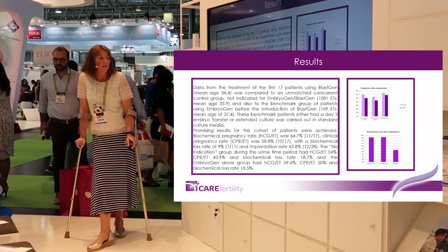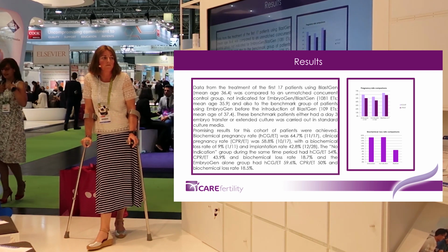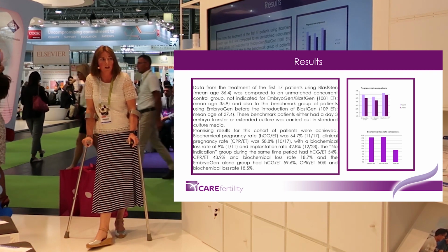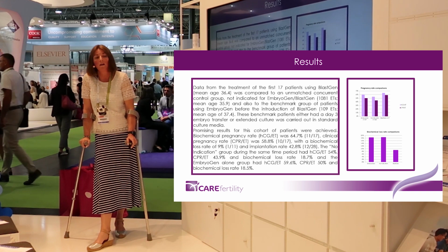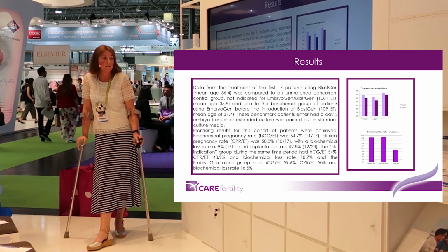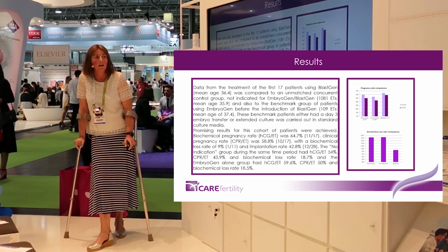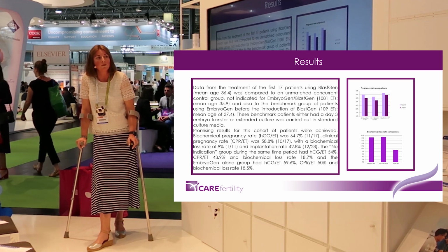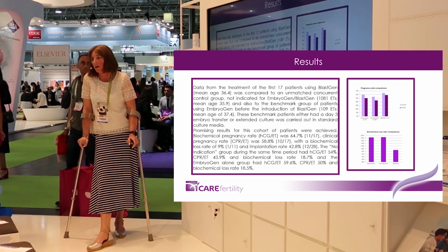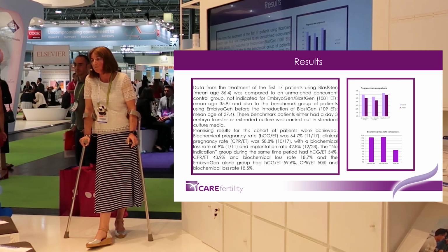So this data was on the first 17 patients that we had using the Blastgen, and obviously the numbers are low and we couldn't show it significantly, but we found a trend towards higher clinical outcomes and a lower biochemical loss rate using the Blastgen.